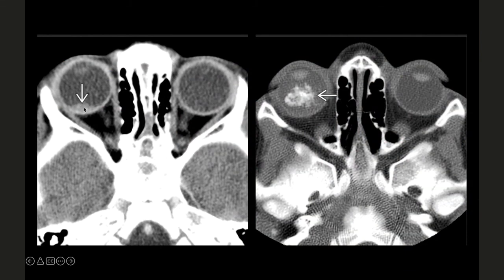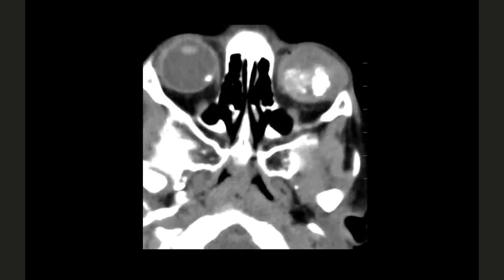So this person has a soft tissue nodule. Okay, this looks like a retinoblastoma, but then it can be other things too. However, by the time I see all these calcifications, retinoblastoma. It's a small head, it's a baby, so that favors more of a retinoblastoma. That one was unilateral, this one is bilateral. By the time I see one eye completely distorted, all calcified, distorting the whole globe, and I see a speck of calcification in the other one, I'm going to be worried about bilateral.